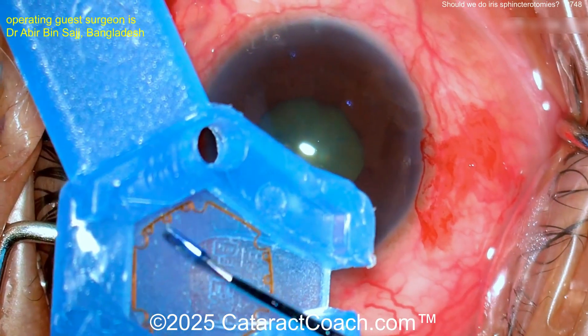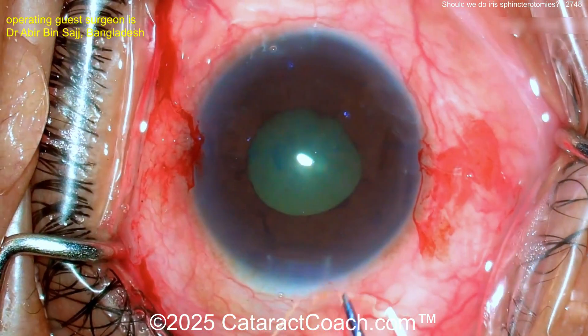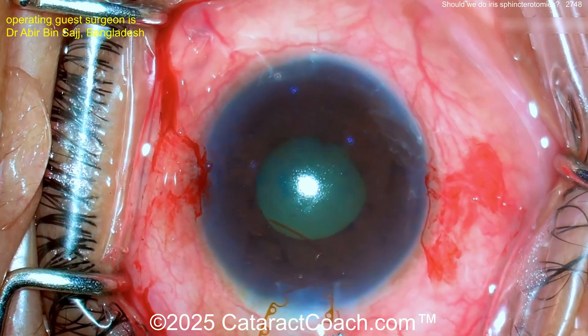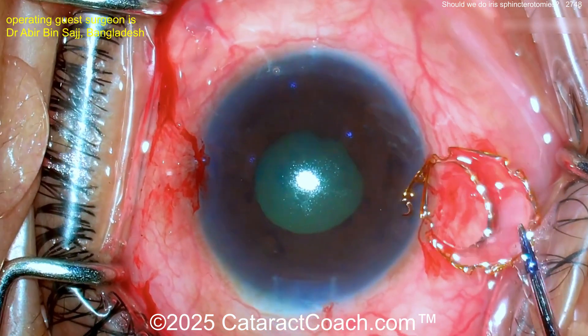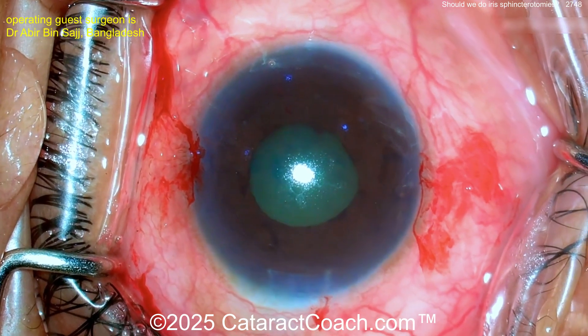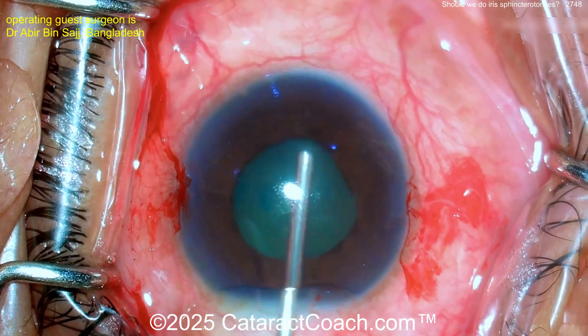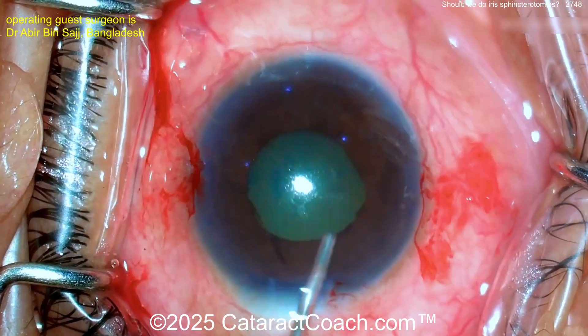The surgeon is going to try to use a B-Hex ring — a pupil expansion ring — placing it inside the eye. And look at that: it breaks. In the notes, the surgeon who sent the video said that was the only one in the whole center, so there are no other pupil expansion rings available.